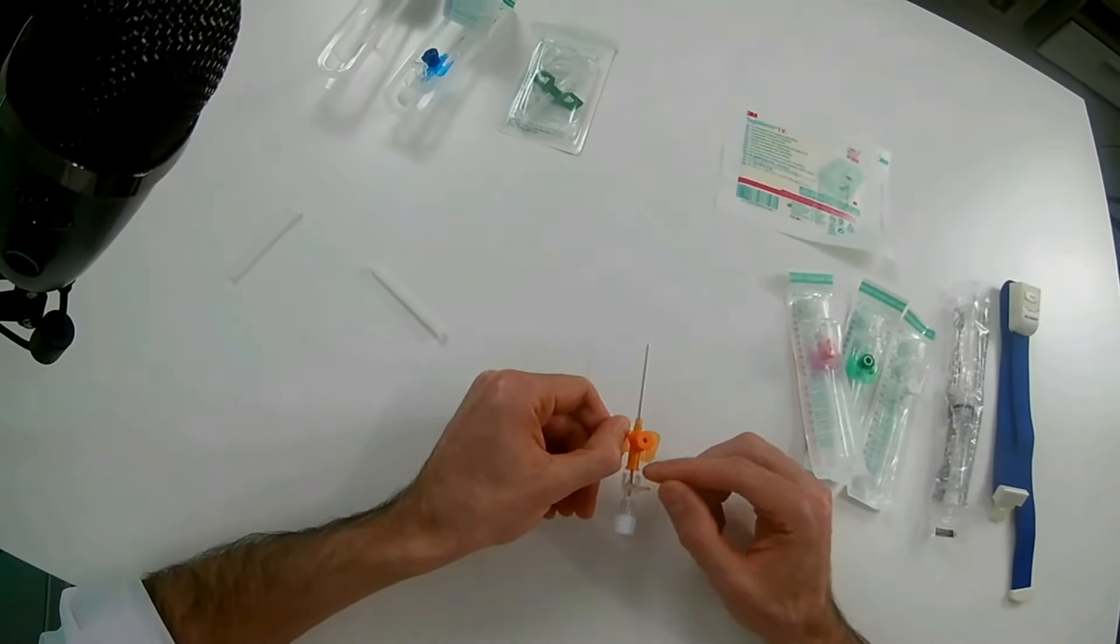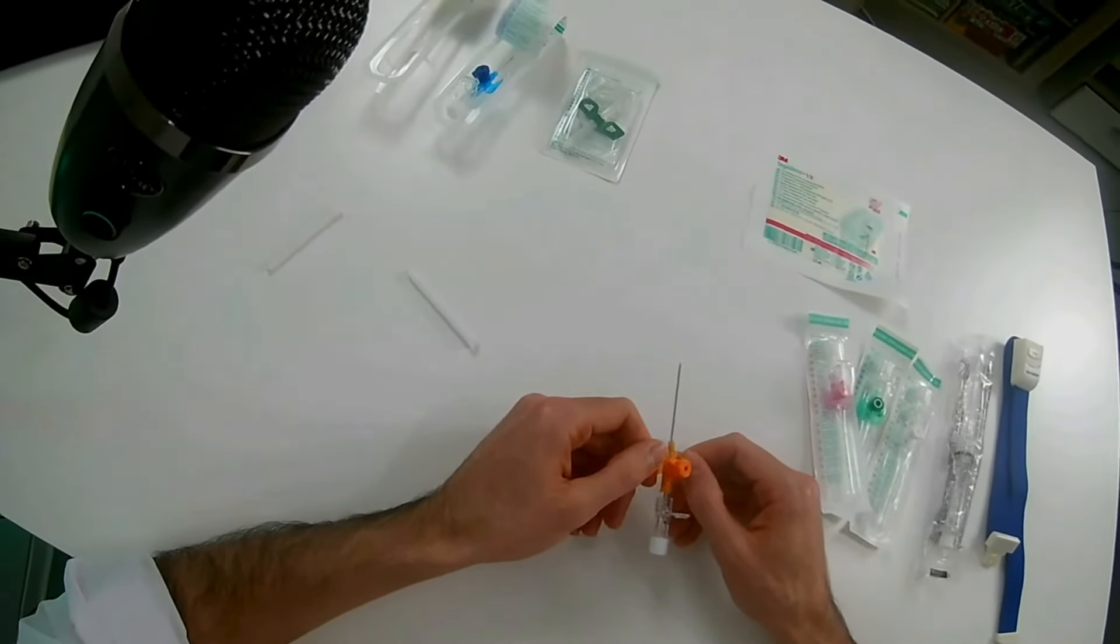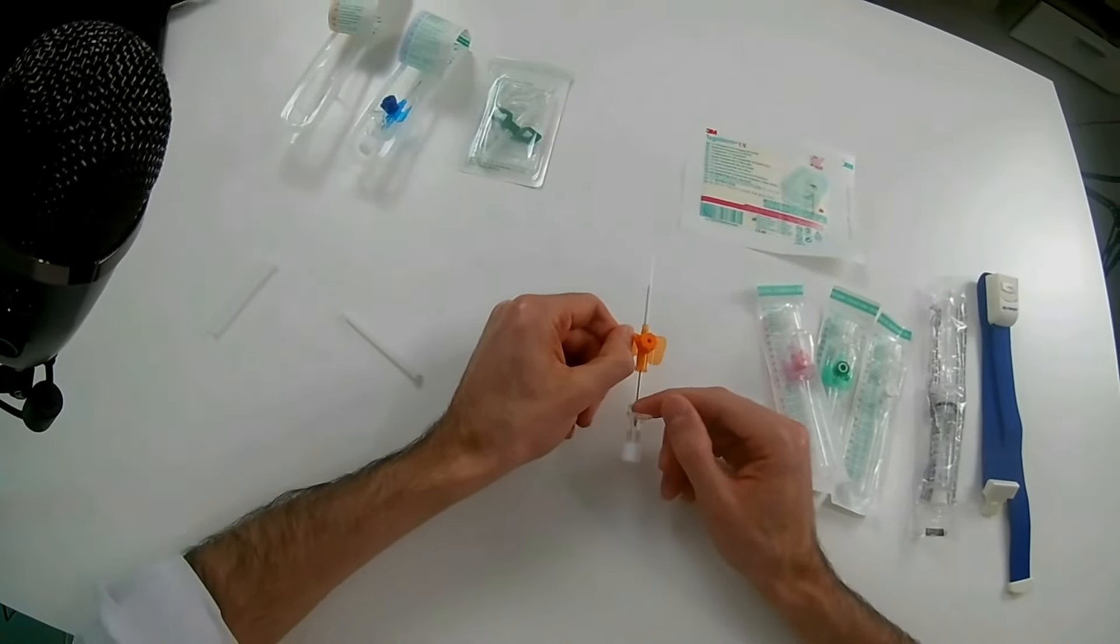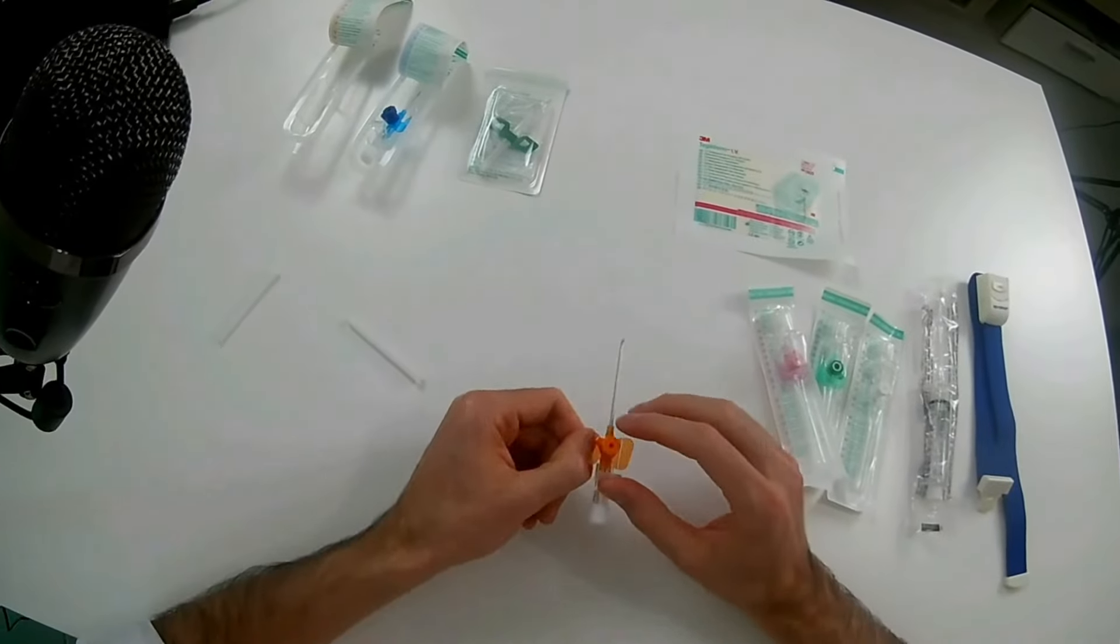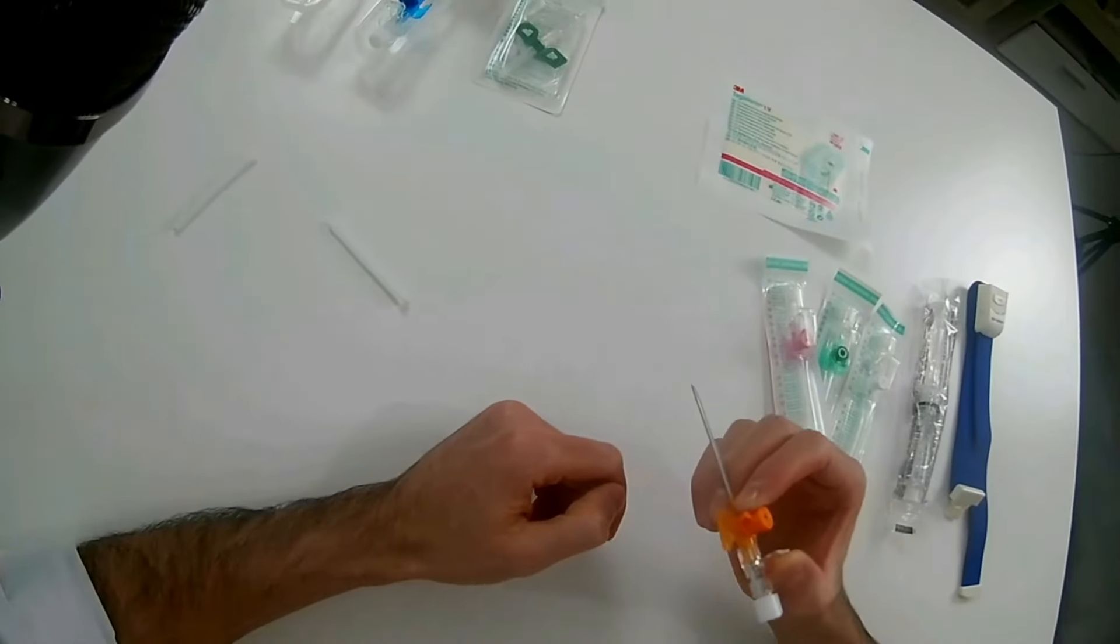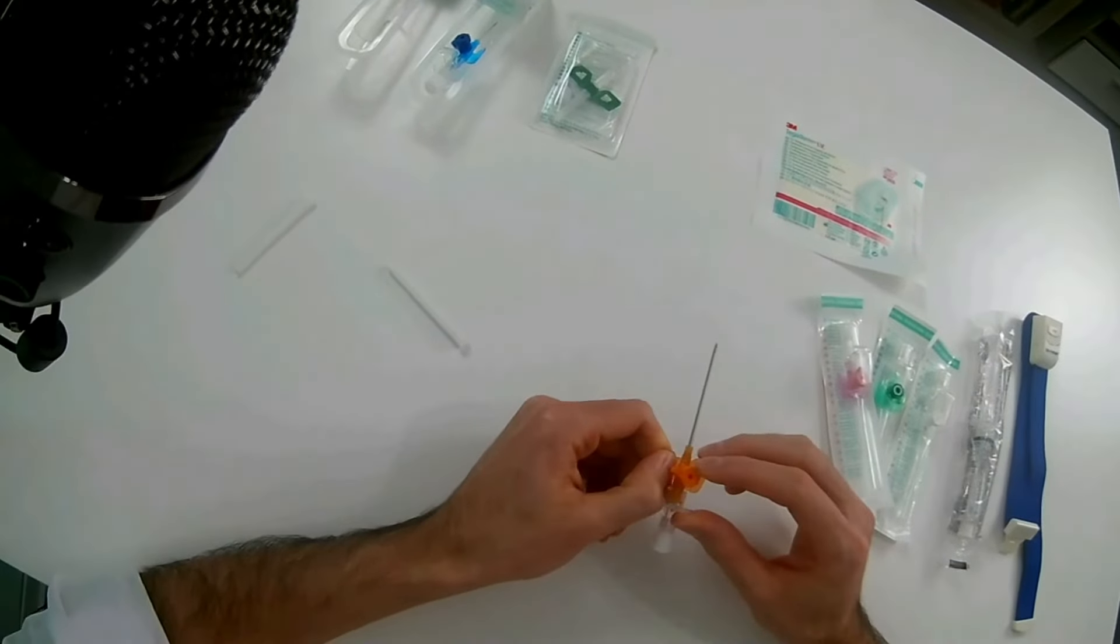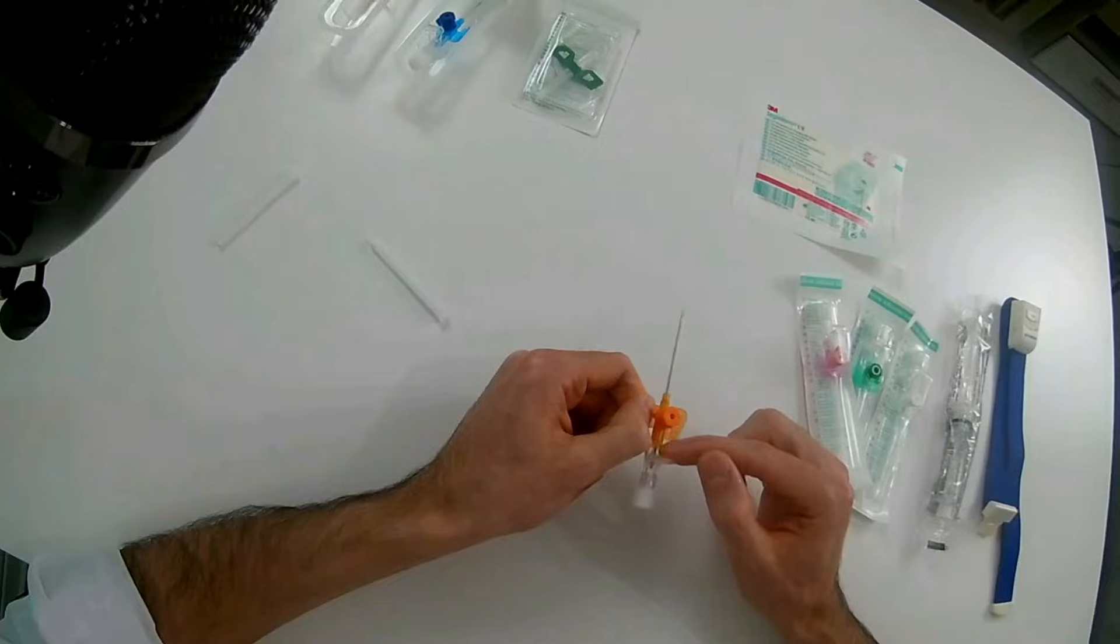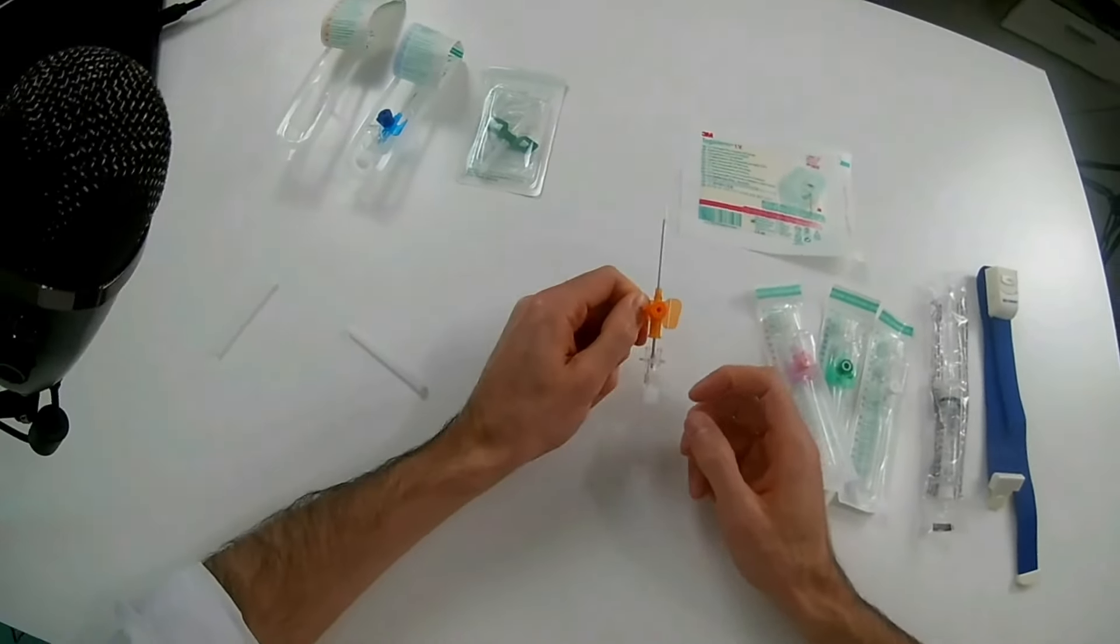When that happens, technically you could go a bit further forward, pull the needle back a bit so that you wouldn't harm the vein anymore, and then you could pull forward. As you pull forward, you could also retract the needle. The idea is that with the needle you go through the skin. Once you meet the blood, you don't need a needle anymore because you are already inside the vein. So you retract the needle and then you go atraumatically inside.